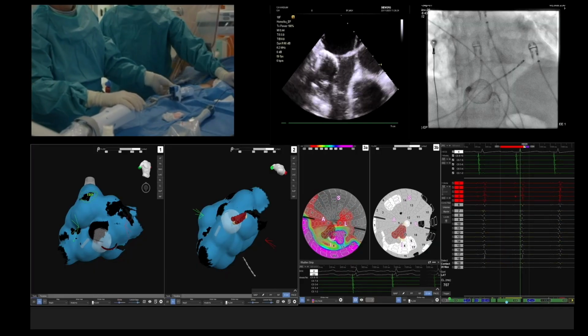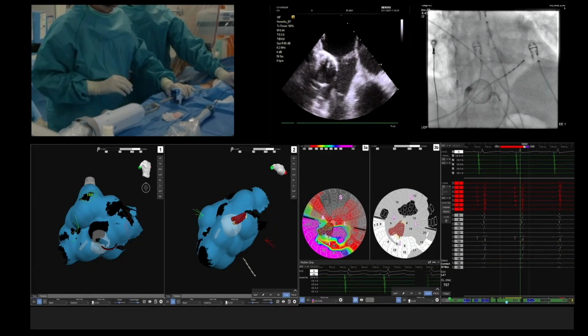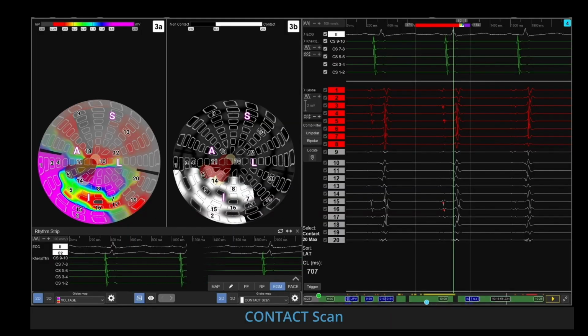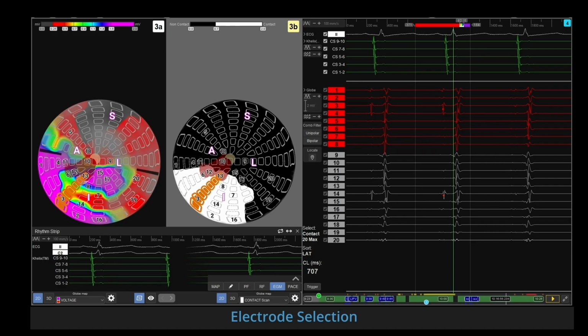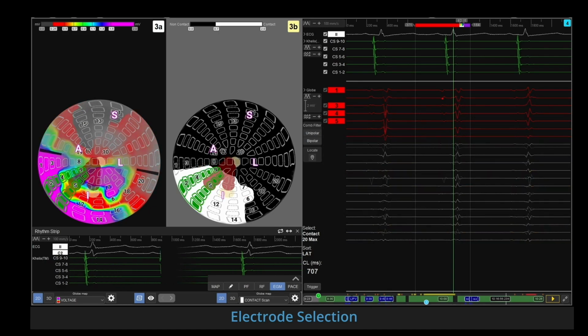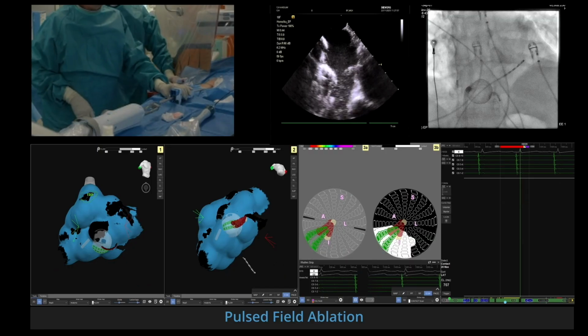So time is what the system uses in order to let the heat percolate into the tissue, because they're wide electrodes, so your heating element is big, and that allows you to project. What's the downside? Time. So the lesion is much longer. It's like a 2-minute lesion or something. So that I don't like.